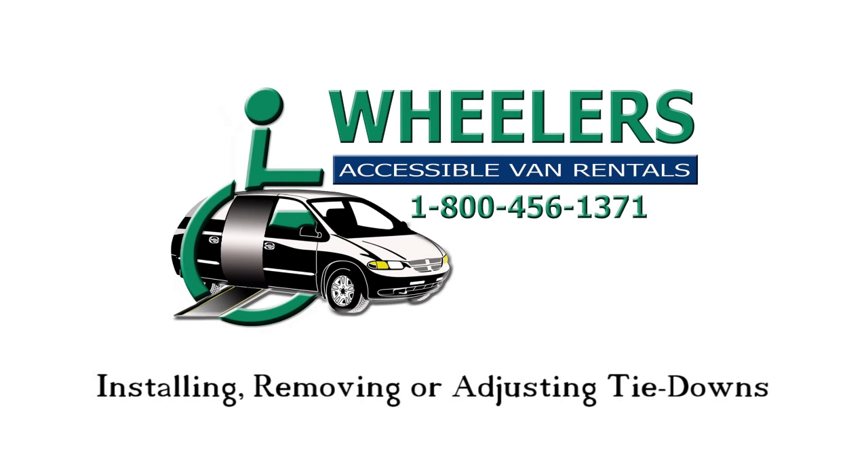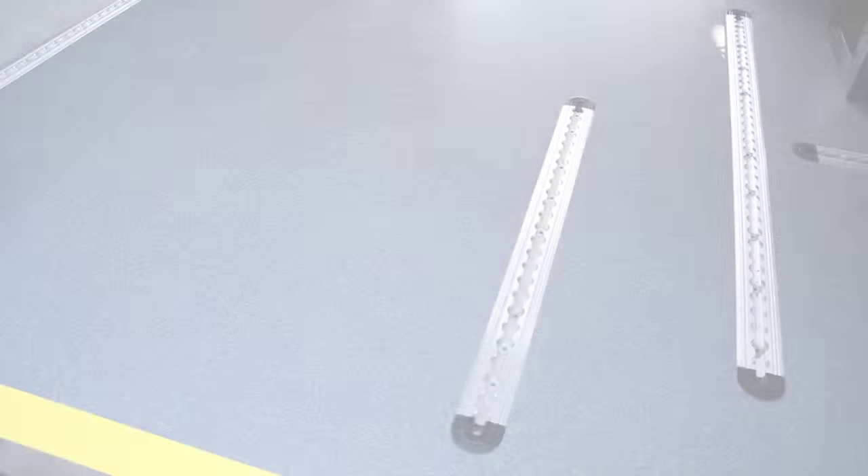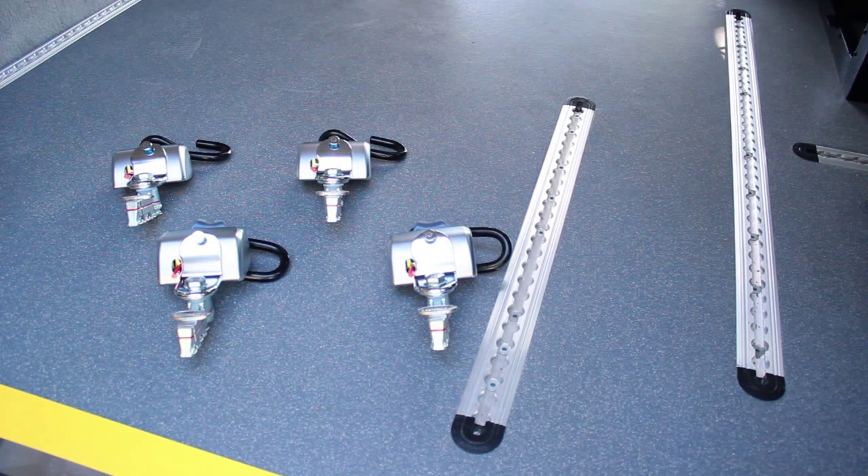Installing, removing, or adjusting the wheelchair tie-downs is easy. First, locate all four tie-down restraints.